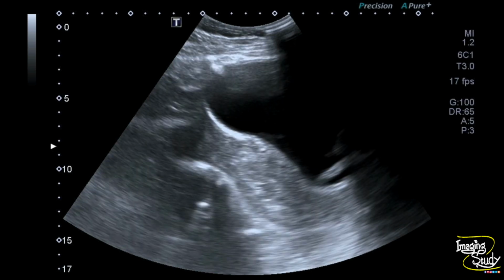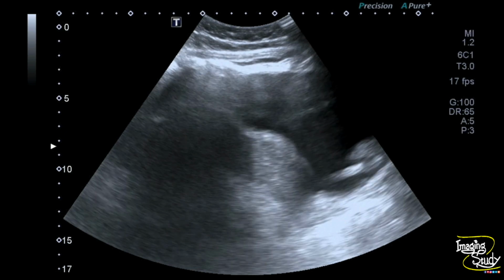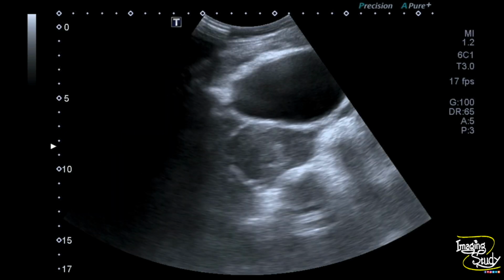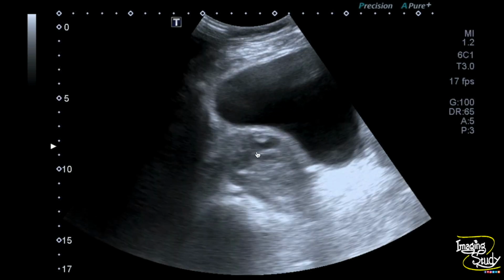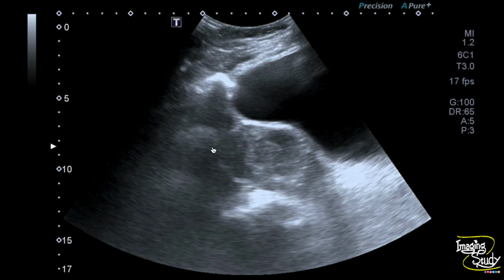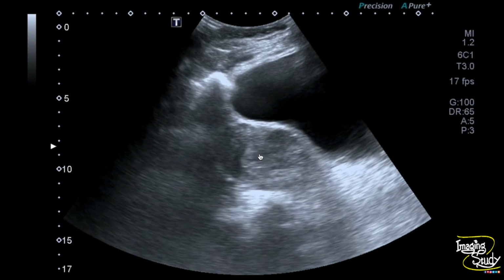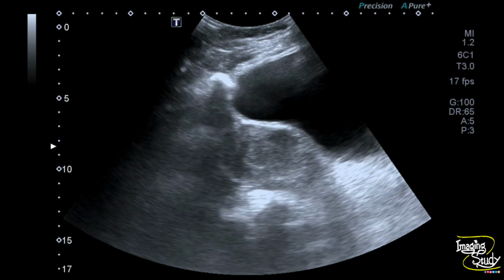The patient was under catheterization. Here on the transverse section, this is the hypoechoic collection. There is a breach of the perimetrium at this point. This hypoechoic collection is the hematoma due to the uterine perforation during the DNC procedure.